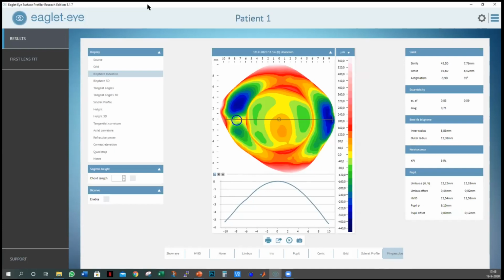Doesn't it speak volumes that if this is the toricity of this eye and it's bearing 360, then the toricity of the lens is pretty impressive? Despite the fact it's touching, it's a uniform touch. Yeah, Brian, I did not think about whether it is related to the large HVID, which is quite common in Cyprus. Or can you just ramp up the LCC, the limbal clearance? I'm not sure, I just went into it. Okay, perhaps that's something to discuss next time in a future user forum.